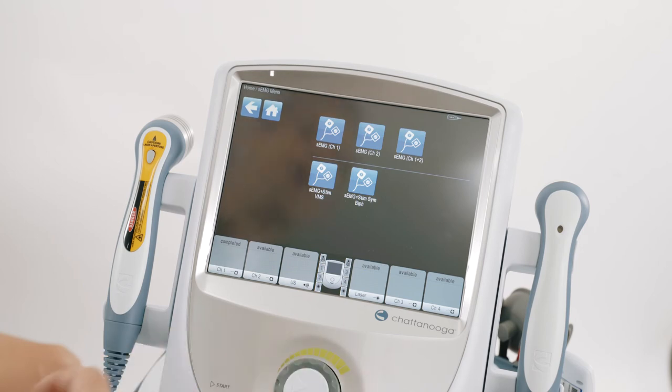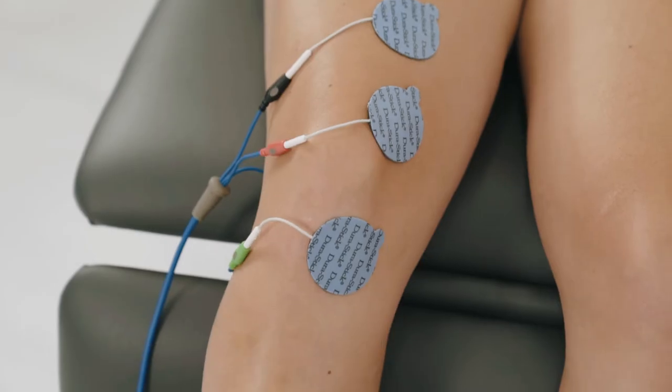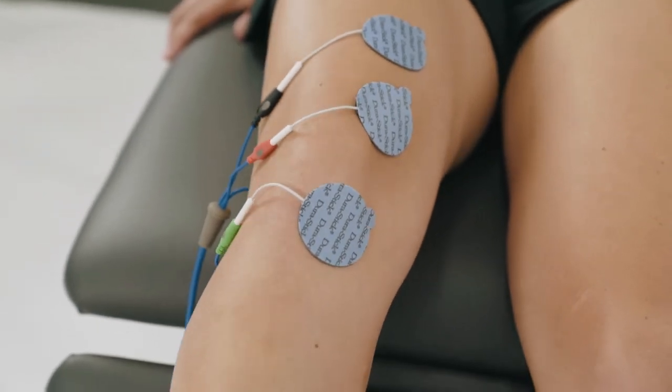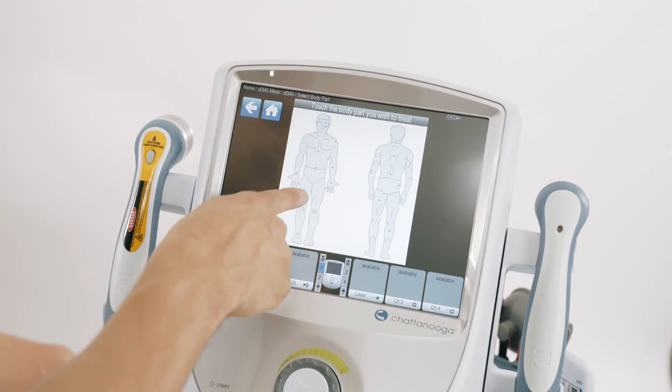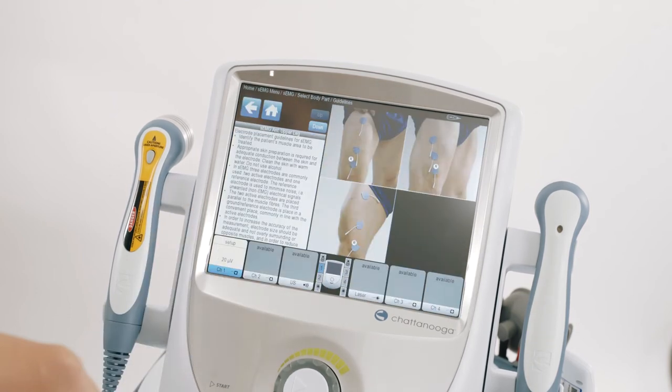I'm now going to show you how to do EMG triggered stim. Place the electrodes on the patient — you can use the guidelines. Touch the body part you wish to treat. As you can see, the machine helps you with the correct placement of the electrodes to ensure the correct EMG biofeedback is measured.